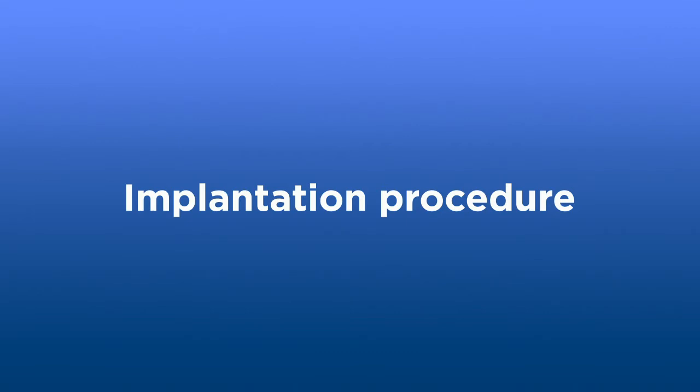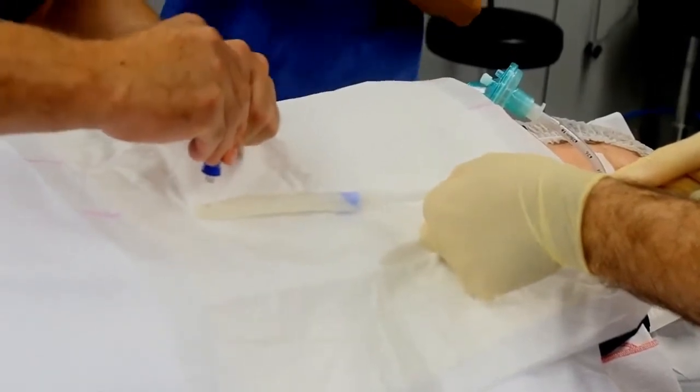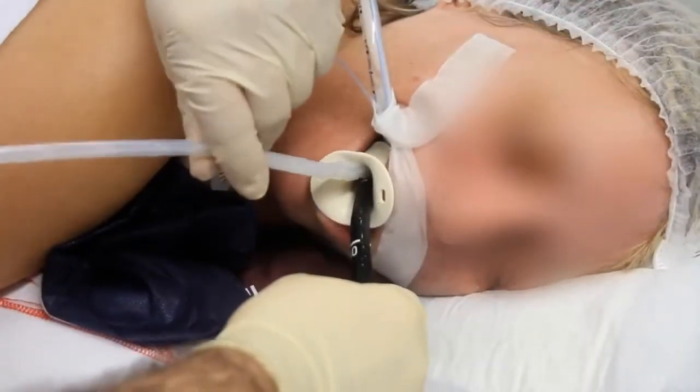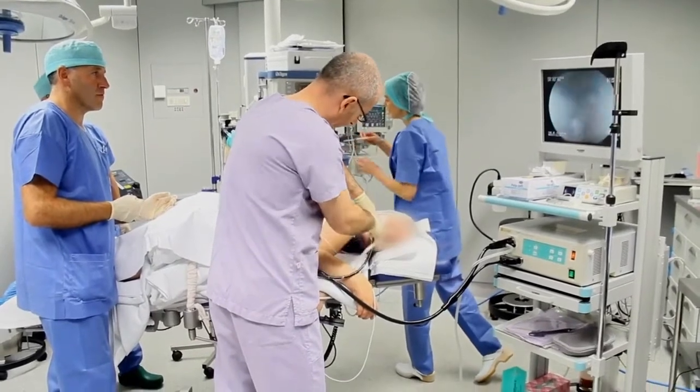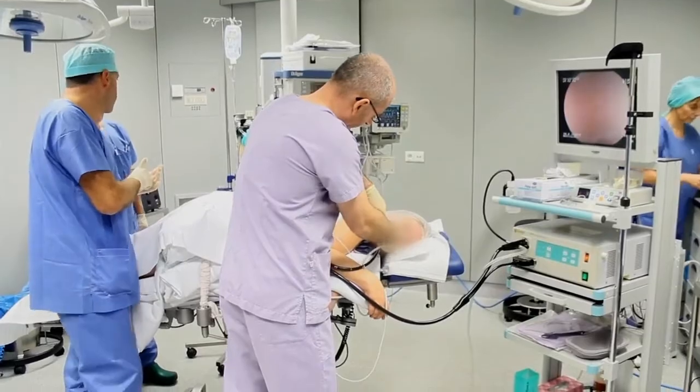Implantation procedure. First, lubricate with a surgical gel the protective cover and a catheter which is pre-connected to the balloon. The balloon is then introduced in its totality into the mouth through a teeth holder. Then, using the index finger as a guide, move the balloon through the Killian area.